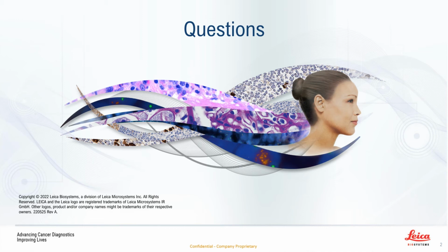We're not as sensitive to it when you're looking down a microscope because you look at each of the slides individually. You're just looking at one H&E, and then if the next one that you put on your microscope is 5 or 10% difference in the staining, you're probably not going to observe that or realize it at that point under the microscope. However, it's some of the power of digital pathology and being able to put those slides side by side in a viewer that really starts to highlight where you will have differences or drift in your staining.